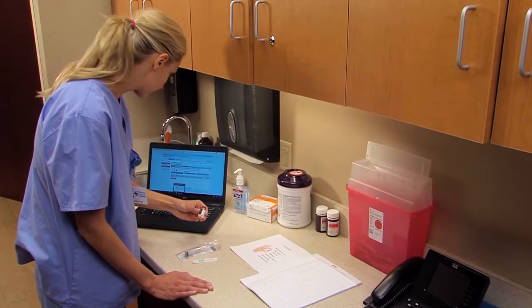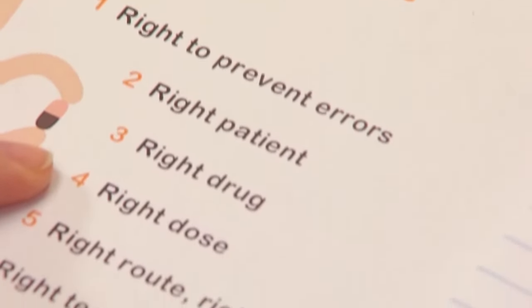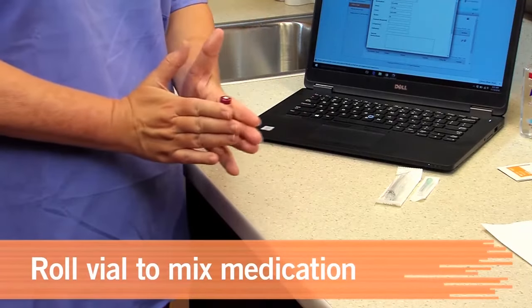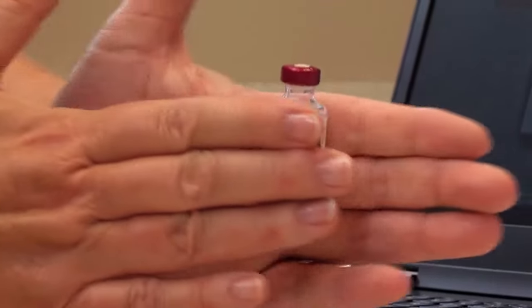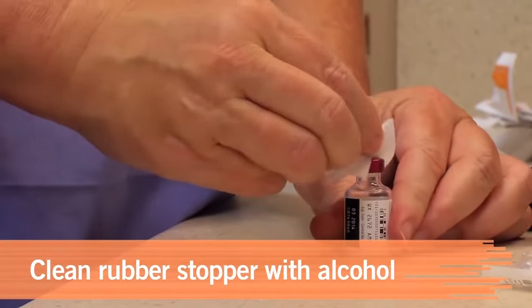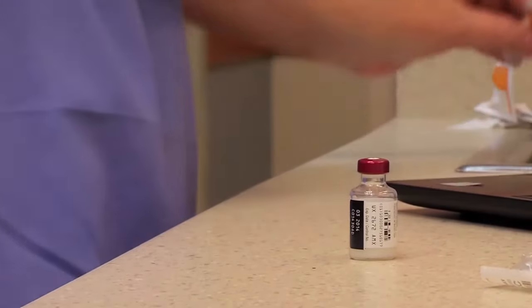Make sure that the strength on the label matches the order and that you dispense the right dose by the right route at the right time. To mix any medication that may have settled, gently roll the vial between your palms. Don't shake the vial, since that may create air bubbles in the medication. Using a circular motion, clean the rubber stopper with an alcohol wipe. Place the vial on a secure, flat surface.